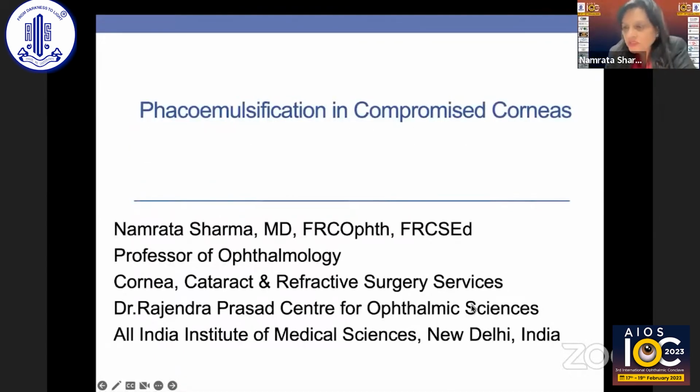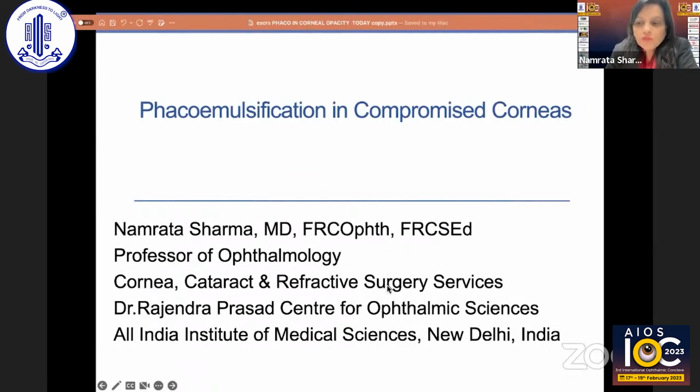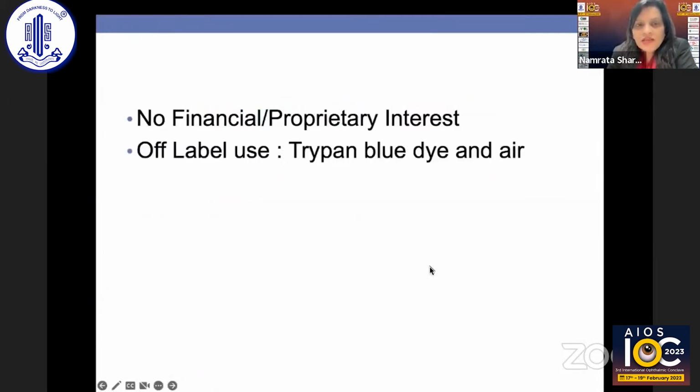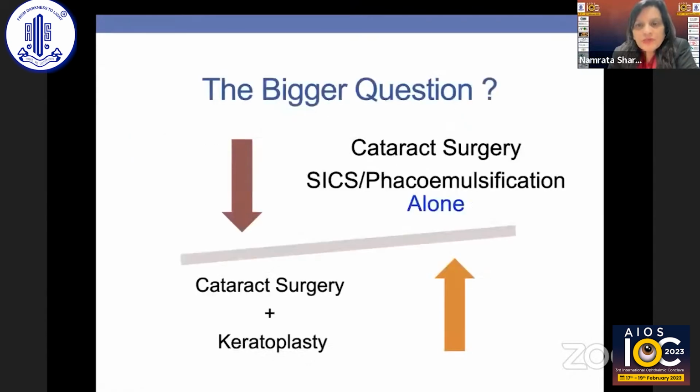So thank you so much, and I will be talking to you about phacoemulsification in compromised corneas or in corneal haze. There are no financial or proprietary interests, and I will be talking about the off-label use of air as well as trypan blue dye.